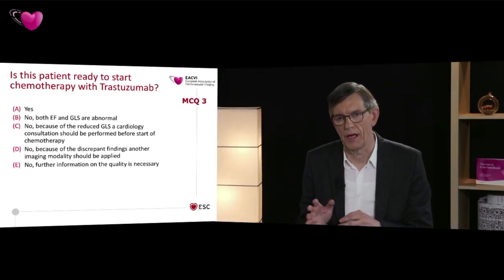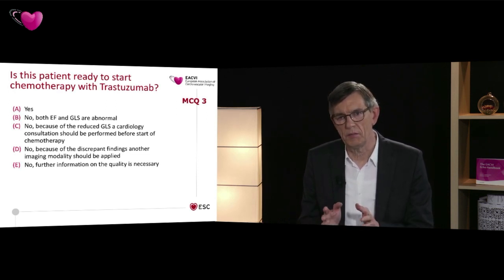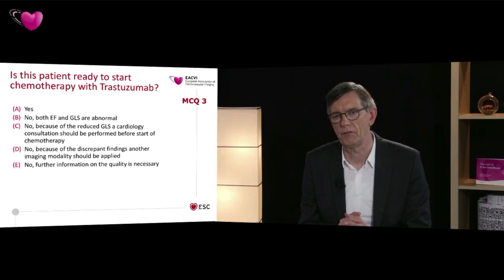There are some activities in measuring strain on contrast images, but they are not yet ready to be recommended in clinical practice. However, I want to say, if the image quality is bad, we have to question the strain results, because strain is only reliable in patients with optimal image quality. And that is also mentioned in a previous guideline paper of the ASE.